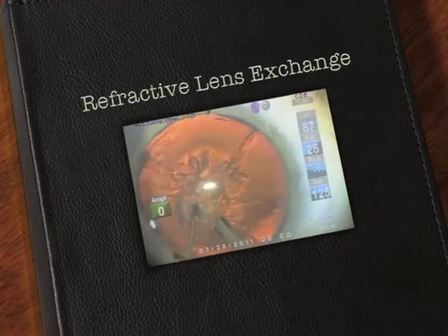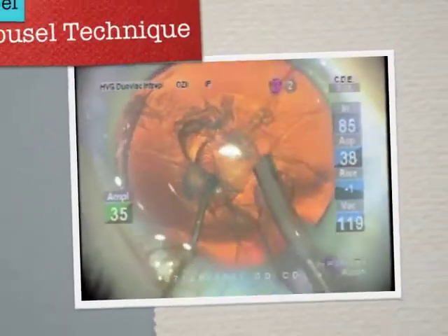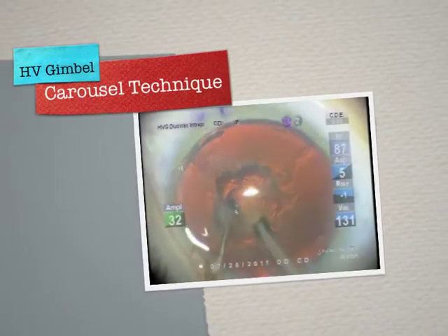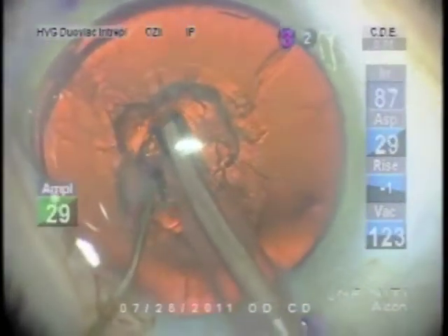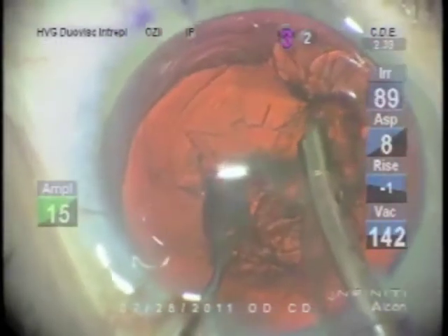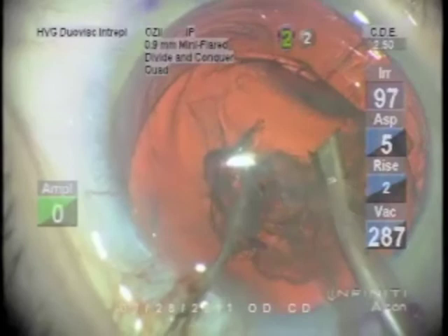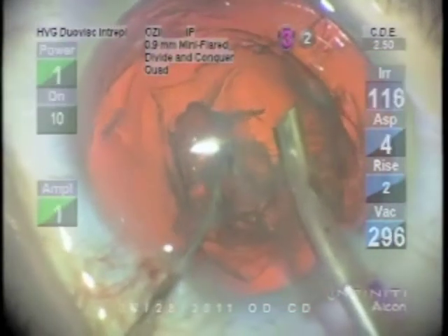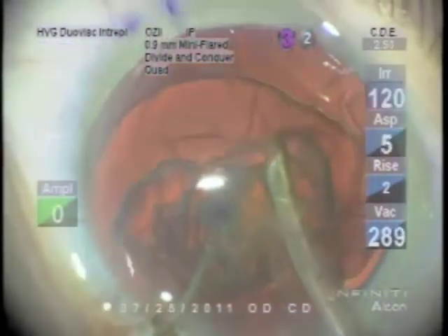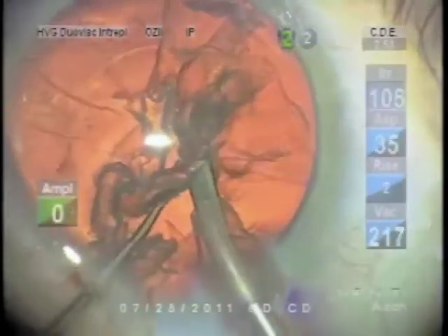Dr. Gimbel showing the carousel technique. Dr. Guy Cannoli in Texas demonstrated this decades ago, but we don't hear it talked about much now. But in refractive lens exchange, where the nucleus is quite soft, it's kind of fun to use this technique and it's quite effective.